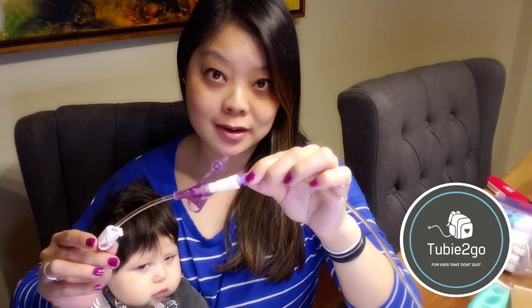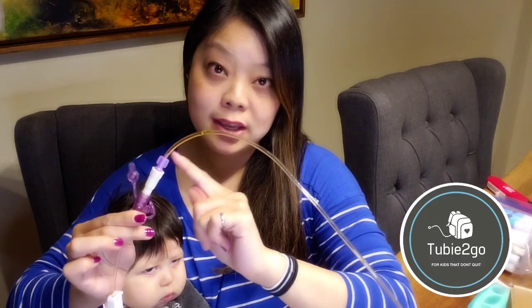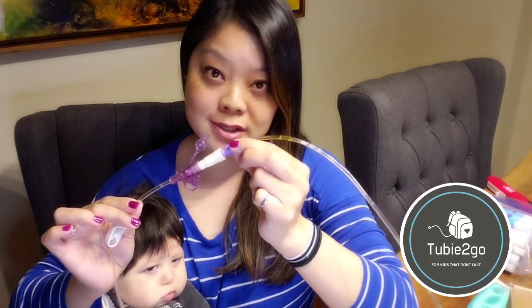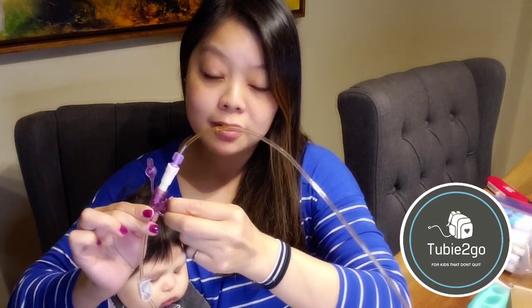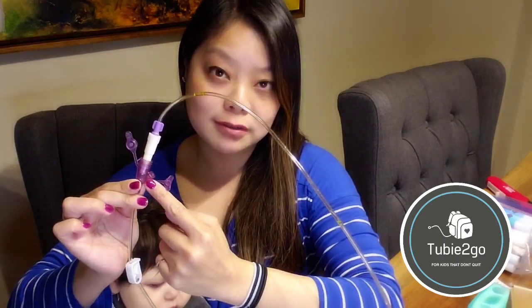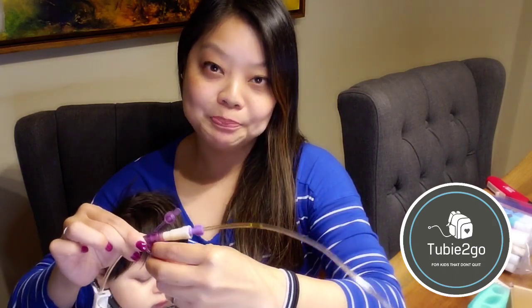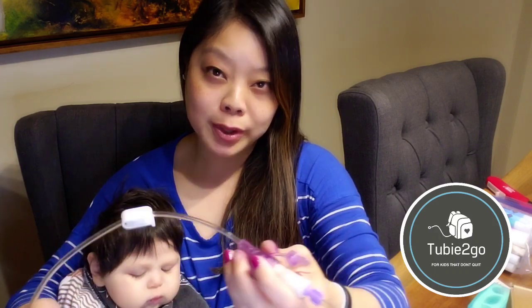So the other reason that you might feed the bed is the feeding tip and the extension stay together, but the med port on the extension pops open. And now again, instead of going into the tummy, it is coming out of the med port and feeding the bed. So what can you do to avoid this? Well, there's a couple different things depending on which issue it is that you're experiencing, whether it's the disconnect or the med port coming open.